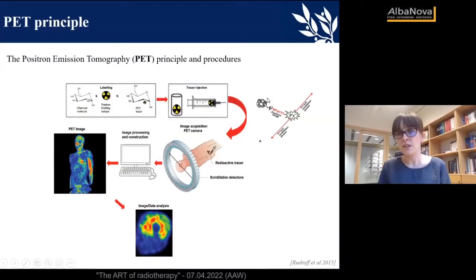And if we look at the physics of positron emission tomography, it is rather simple in the sense that we have a beta plus emitter, so a beta plus particle, a positron, is ejected from the nucleus, and after a certain range, which is on the order of a few millimeters, it will recombine with one of the electrons of the atom of the patient. And then from this annihilation process, 2 gamma rays of 511 keV of energy, which is the rest mass energy of an electron, are emitted, and most often they are emitted at 180 degrees, since this annihilation happens at rest the majority of the times. And these 2 photons are emitted, therefore, in the same so-called line of response, but in different directions.